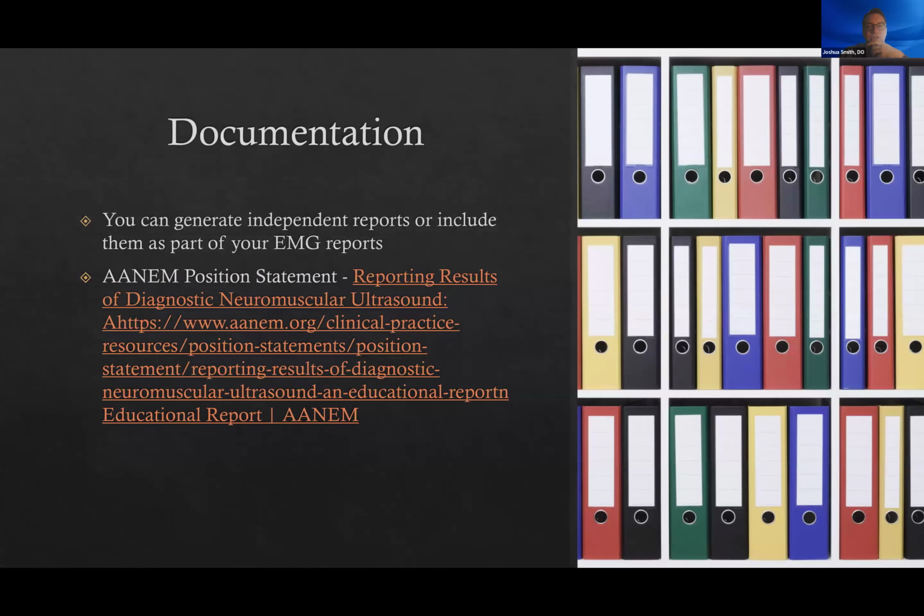So, documentation: you can generate independent reports. If you haven't done nerve conduction and EMG, that is perfectly fine. It's going to be a similar setup to your EMG and nerve conduction study reports regarding the demographics information, and we'll go through that. Or it can be included in the EMG report.